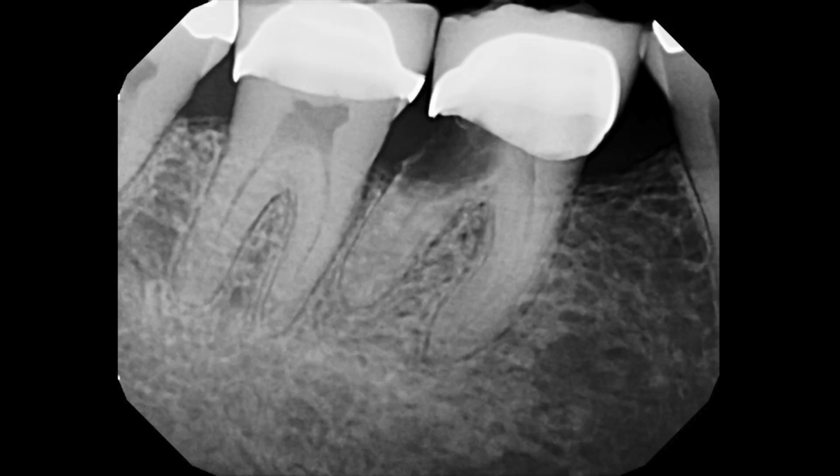If you take a look at this x-ray, this lady came in, and surprisingly this tooth had no discomfort with it, but it had a large area of resorption or decay on the distal root. Decided to have that tooth removed. Went ahead and removed the crown, and after the crown was removed, decided to section the roots just like I always do. But if you'll notice, this tooth had a mesial tip to it.